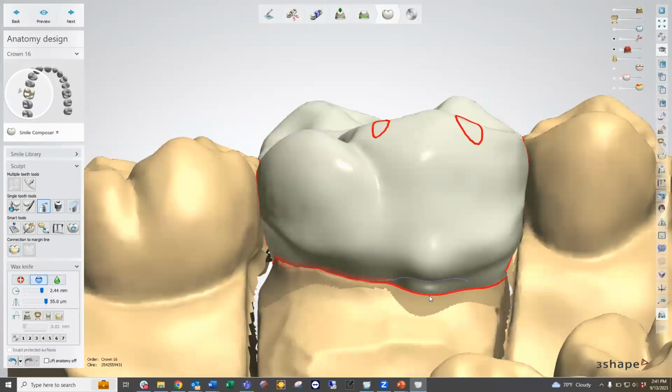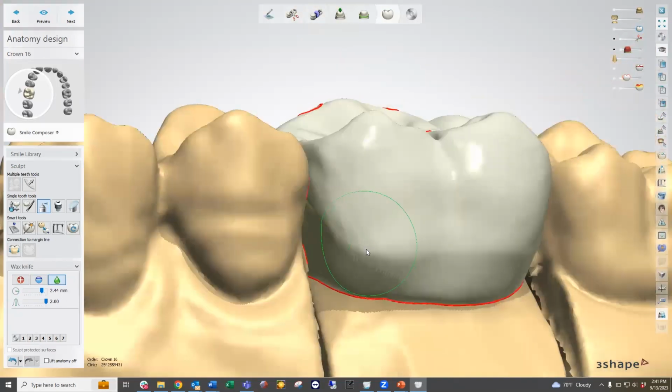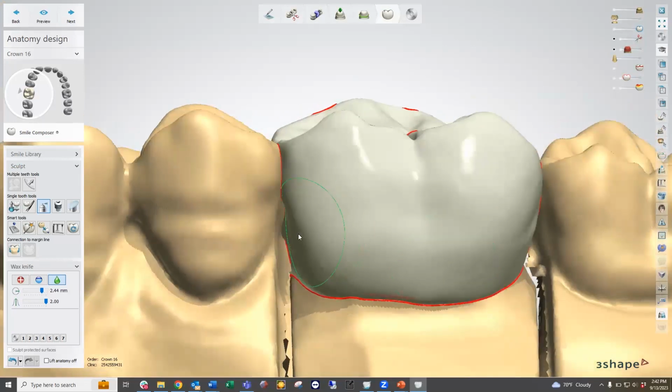We can also do the same thing with the subtracting tool, which allows us to do the inverse of what we just did. Or my favorite tool, which is a smoothing tool, which allows us to fix any errors that we see within our case. I liken this tool to taking an open flame to a wax restoration, where it allows us to fill in any divots or allow the wax to mold into those divoted areas, and then take down the peak areas as well.